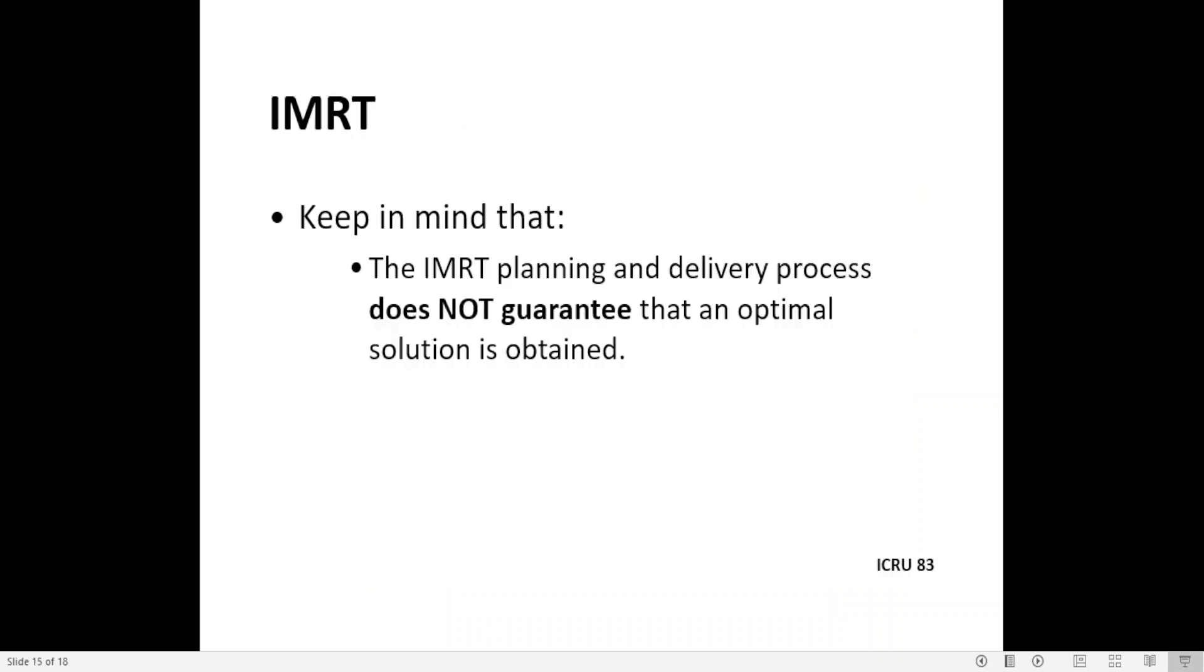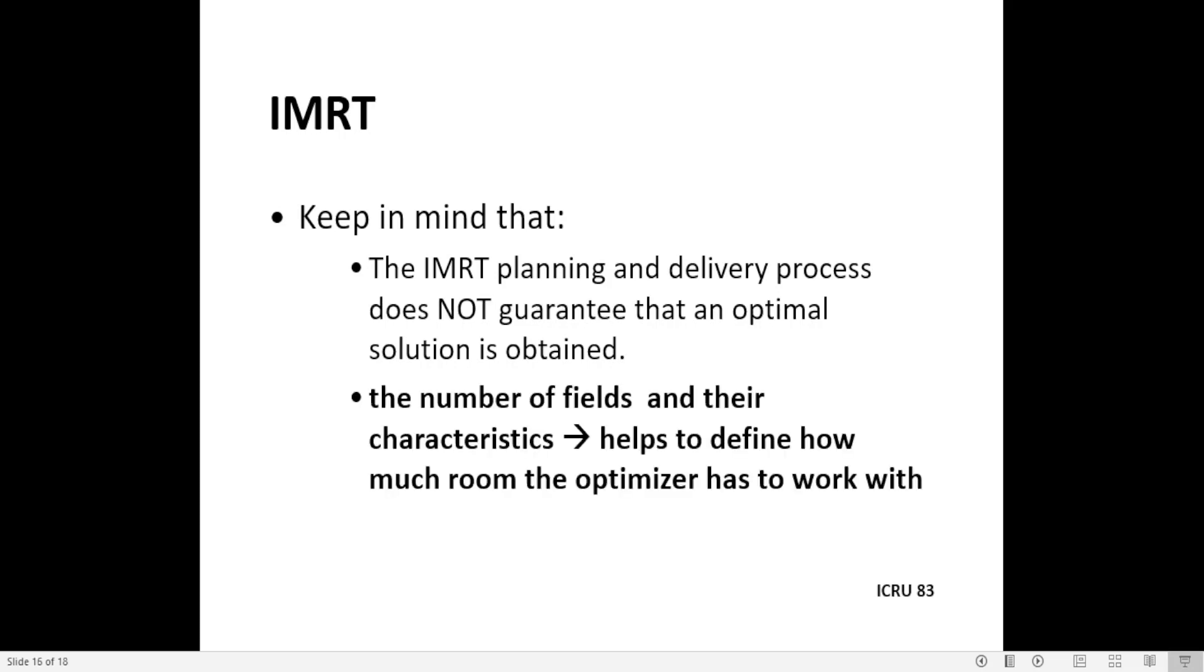Keep in mind that the IMRT planning and delivery process does not guarantee that an optimal solution is obtained. And the number of fields and their characteristics helps to define how much room the optimizer has to work.